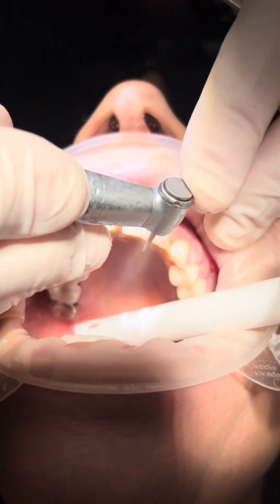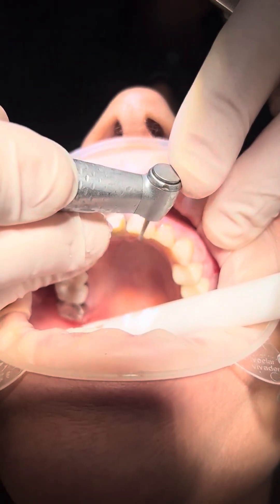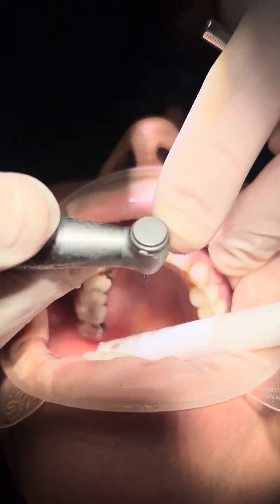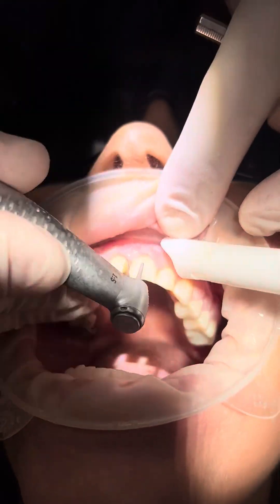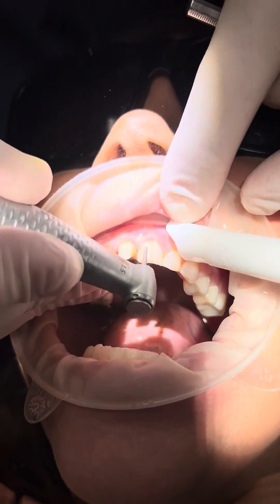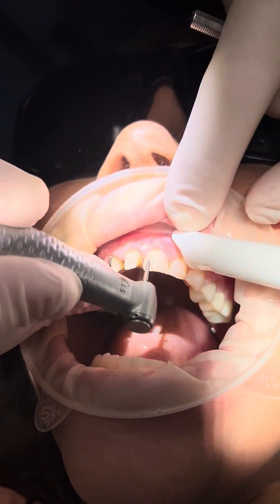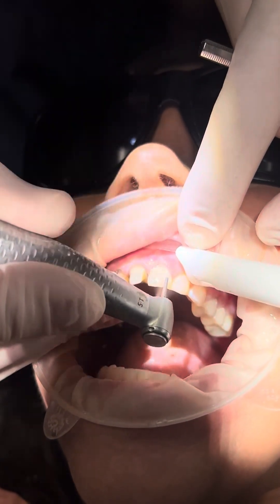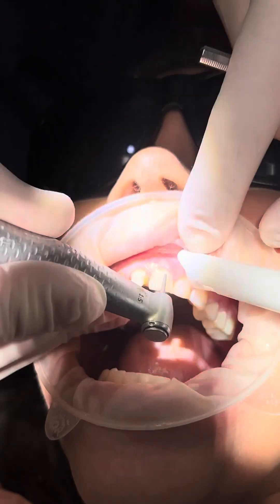About the thickness of the bur, we're going to connect the bur and we're showing in the top two-thirds of the tooth. Now we're going to put on the labial and the buccal — three depth cuts. At least about a one to one and a half millimeter depth.